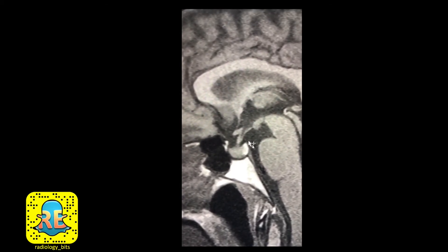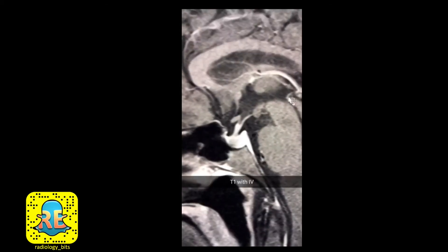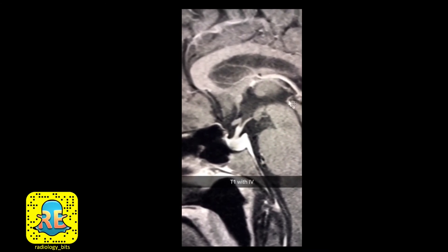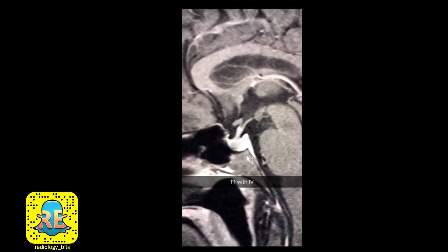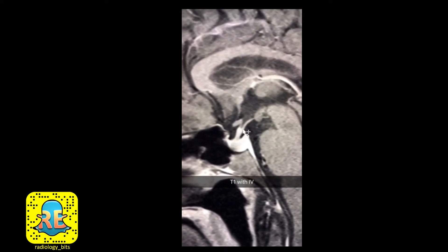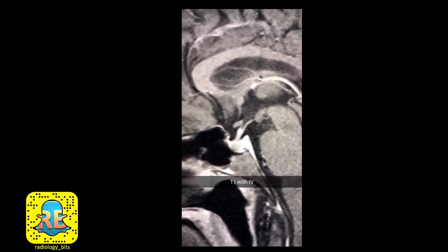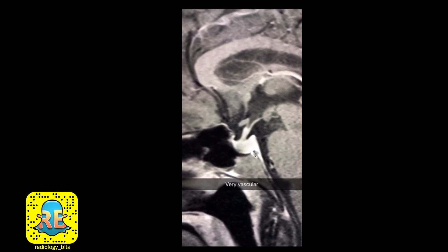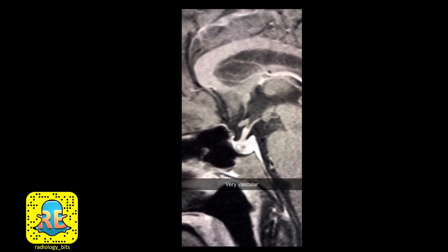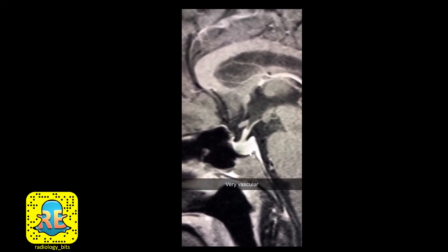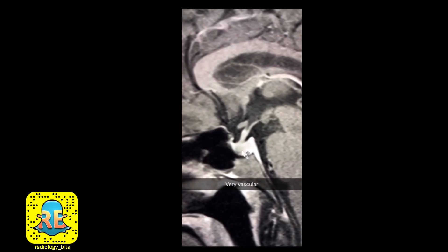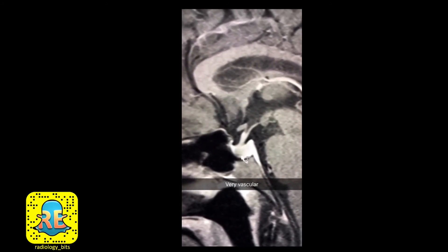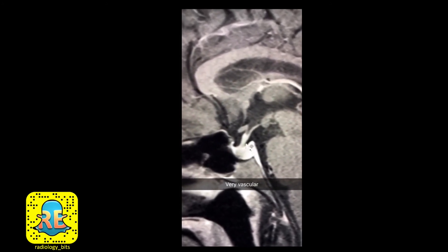This is the stalk and pituitary gland appearance without intravenous contrast. Let's see what happens after contrast administration. This is the same sagittal T1 image after giving contrast — the stalk and pituitary gland are very vascular, which is why they show an extremely bright appearance. This also helps detect any internal pituitary gland abnormalities.